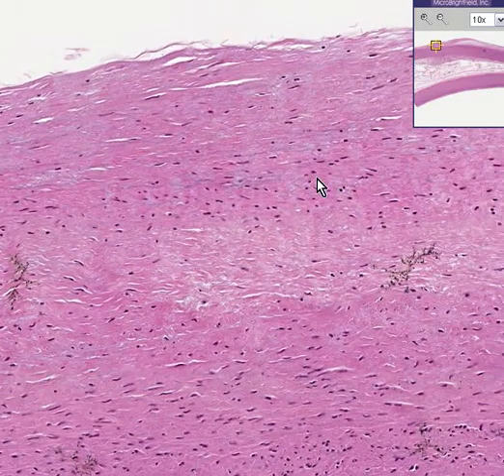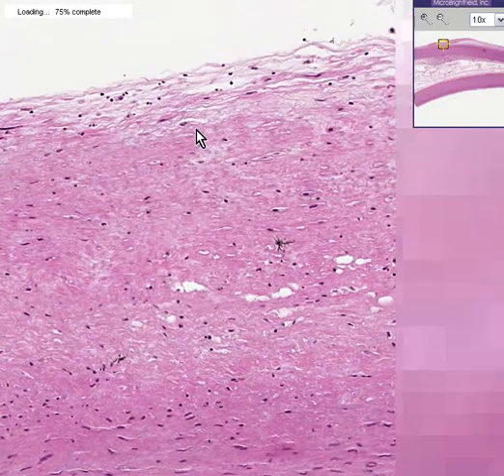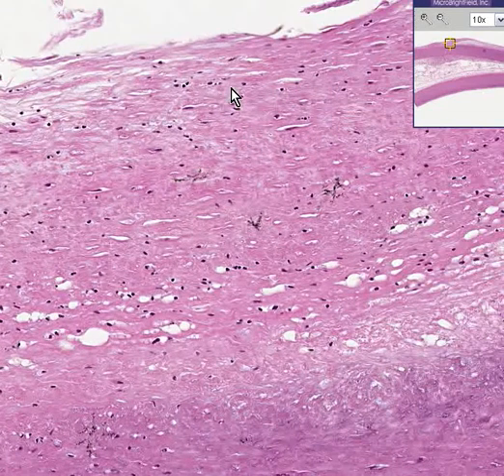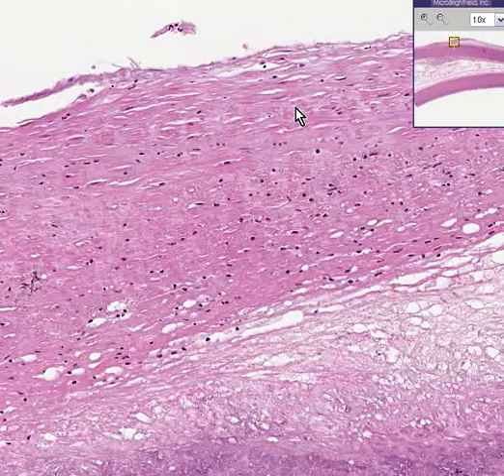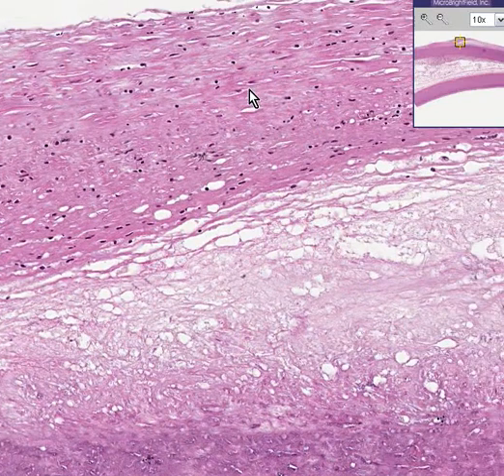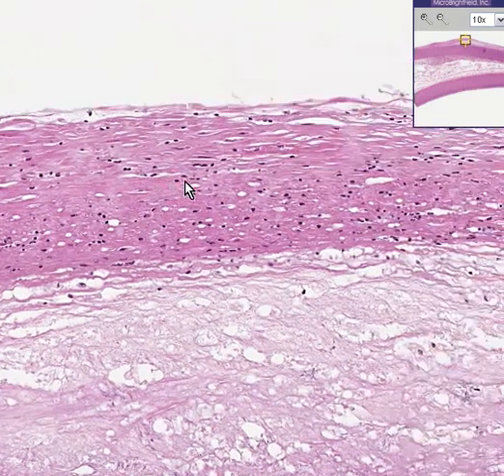Notice how as we get a little bit closer now to the east coast over here, that some of these elastic fibers and smooth muscle cells are getting a little bit whitish. They are being replaced by a kind of a granular, sort of whitish substance. This is precisely what we saw as the fatty streak. If the fatty streak was large enough to be palpated, it could probably be called a plaque. So here is a plaque.